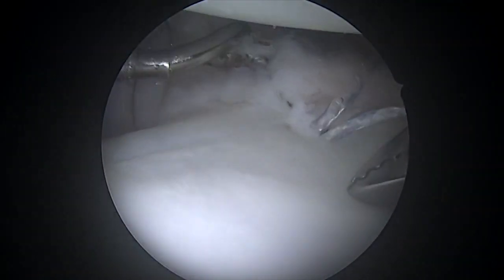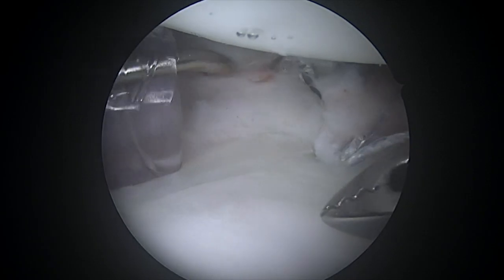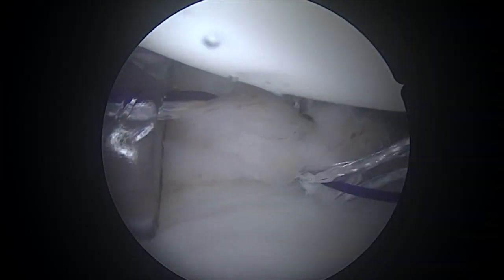You can see how as we come around, this creates what looks like a bumper — a mountain of tissue right next to the socket. That mountain further keeps the ball centered within the socket. It serves as a bumper, kind of like bumpers in a bowling alley, to prevent the ball from coming out of the socket.